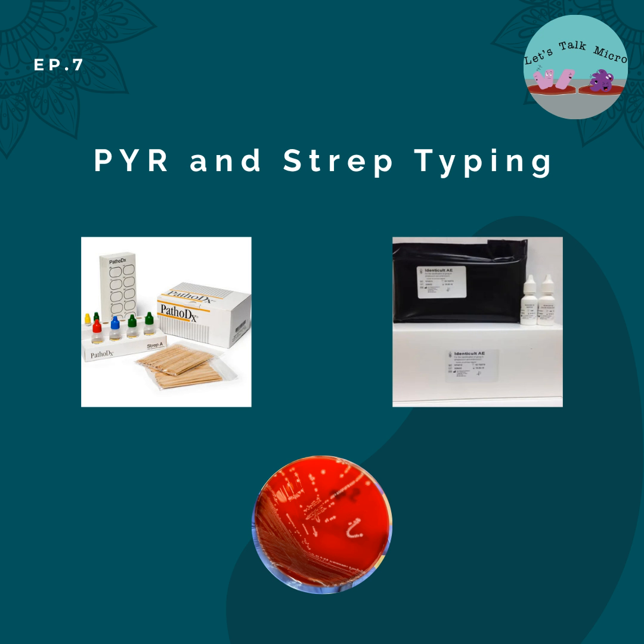Follow your package insert. Sometimes the cards need a little bit of mechanical help, so you can place them on a rotator for a little bit. Just always make sure you check the package insert. So that's what a positive versus negative result on a strep typing is.